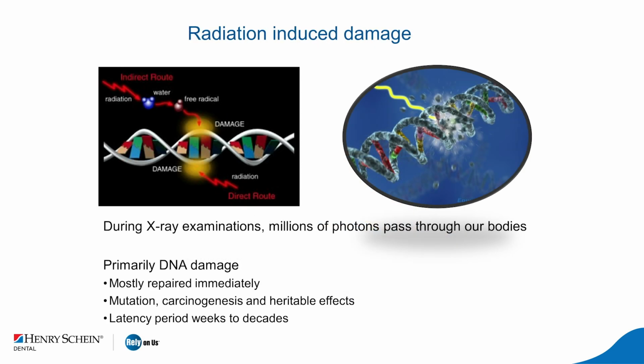So are we right to be afraid of radiographs? Well, the answer is yes, because it can create damage to the DNA. Is it the only thing that can create damage? No, if you're exposed to any polluting agent, and in daily life, we're also exposed to radiation. So you don't necessarily only need to go to the dentist or to nuclear medicine to be exposed to radiation.